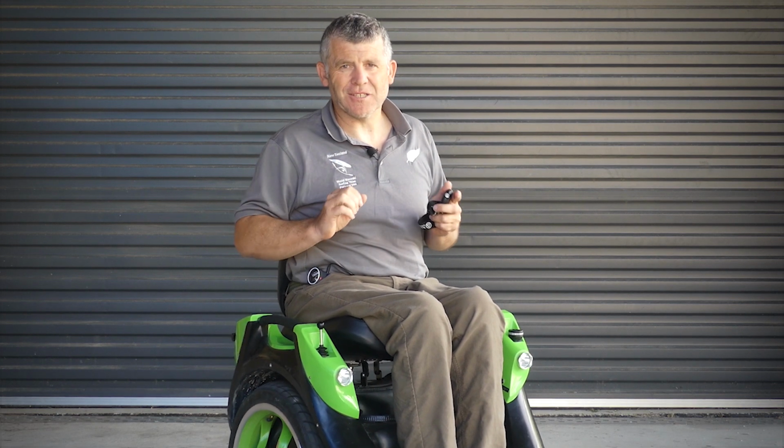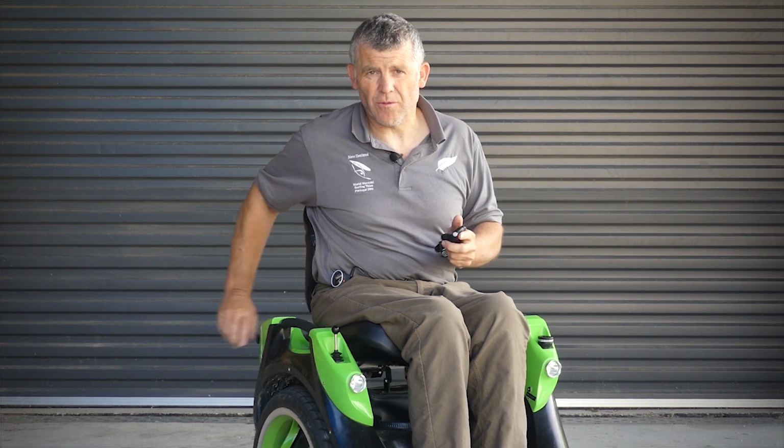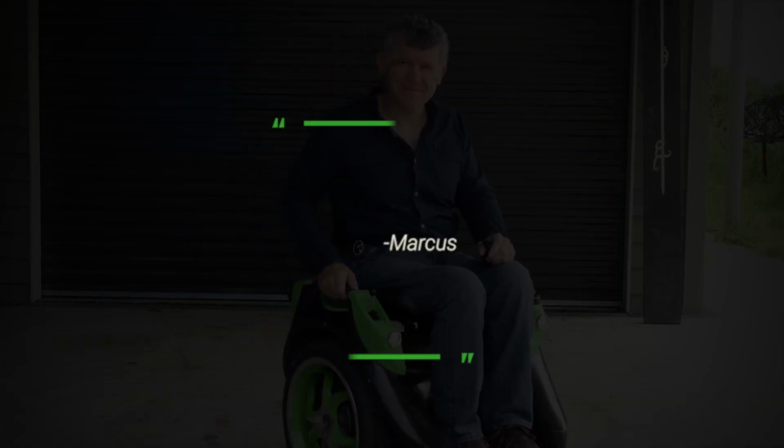Work on your systems, practice good habits, and always, please, make sure that before you put the lever over to active seat control when you're on the flat, that your seat is level. Be out there, practice, and enjoy.